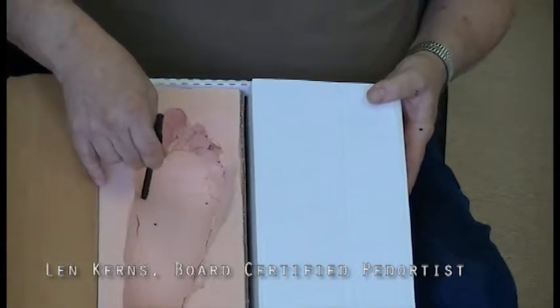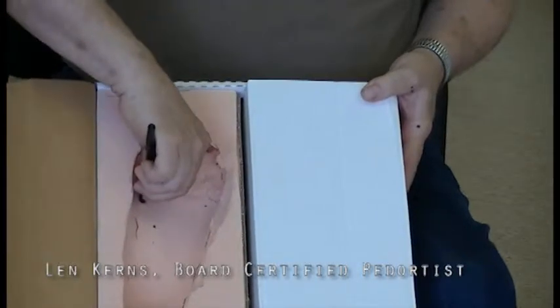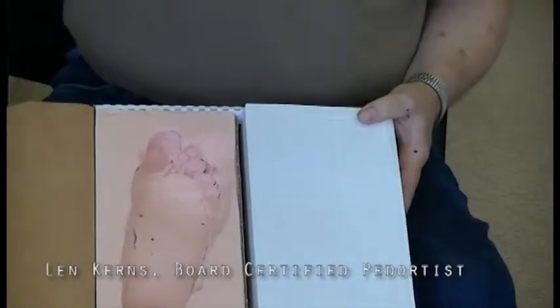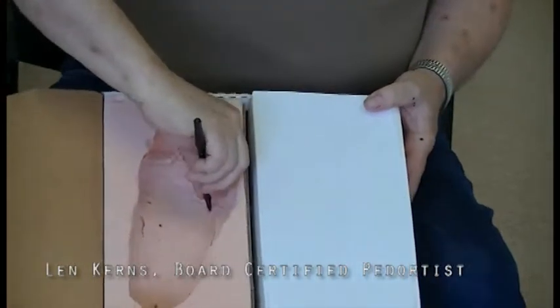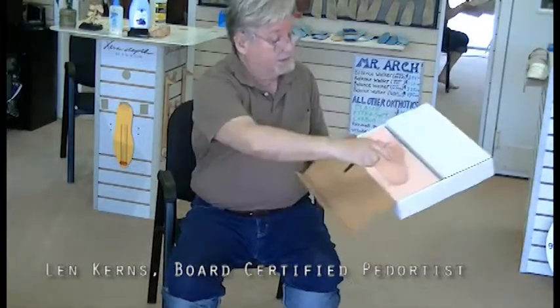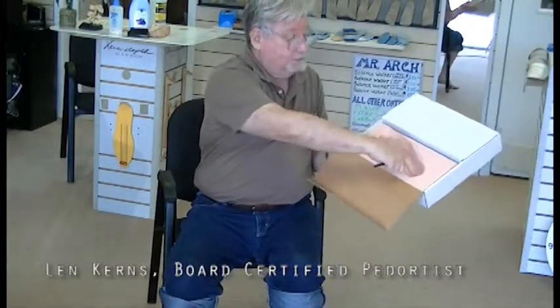And I pushed the pen down here. It made a bigger hole, and it also showed you how much it's off the bottom of the box. The fifth metatarsal is almost at the bottom, allowing for the thickness of the foam to crush, and the center of the heel. Also, look and see the lateral side is all the way down.